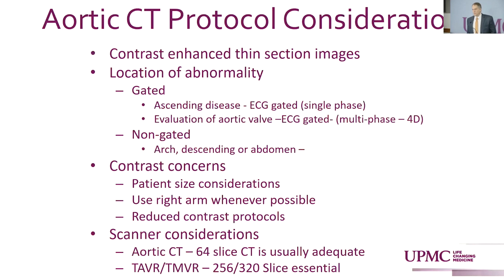So to start off, the basic aortic CT protocol for us: we use contrast-enhanced thin section images, angiography, and arterial phase, and every vendor that's out there is able to produce these. Generally, we look for a minimum of 64 slices to produce standard of care images. Generally, if you're using lower scanners, you're probably going to run into issues with timing, being able to meet up with the standard of care. Also, the larger detector widths and dual source scanners provide additional benefit and opportunities for improvement.